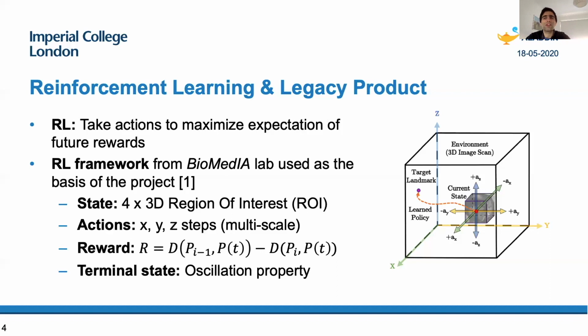In reinforcement learning, an agent operates within an environment and takes actions to maximize the expectation of future rewards. During training, the agent interacts with the environment and accumulates experience that it then uses to gradually improve the accuracy of the value function. The value function is then used to assess the available actions, and the agent uses these assessments to form a policy. In recent years, significant developments have been made in the field, most importantly with the use of neural networks to approximate this value function.